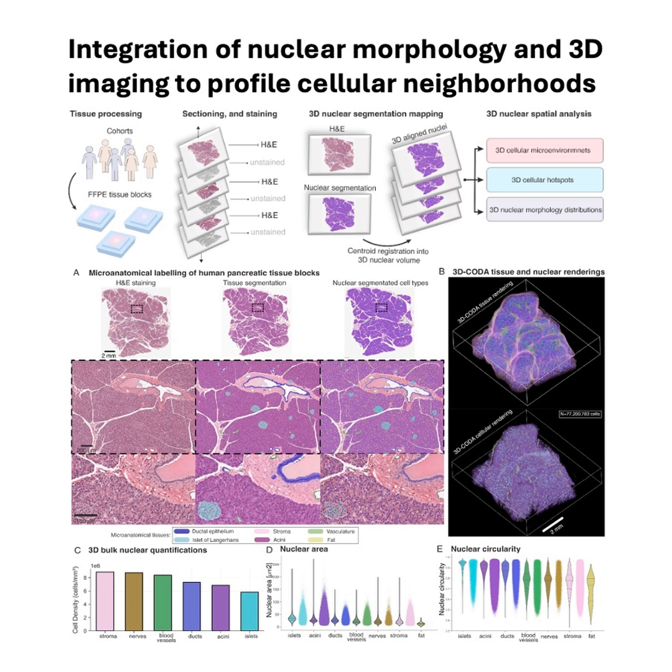Yes, this was a key application they demonstrated. Can we actually classify different cell types just using these nuclear morphology features we extracted? Just from the shape and texture data. Just from the nuclear features, yes. They trained a sophisticated AI model. It's called a random forest classifier. Think of it as using lots of decision trees together to make a really robust prediction.